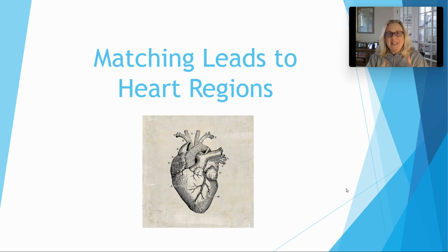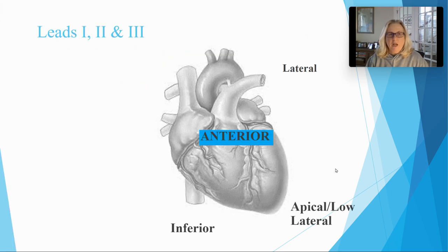So we're going to match these directly to our EKGs that we've been using, practicing on. So here's where we go. Let's get started. Okay, so this is what the heart looks like in your notes. I have your note sheets in front of me, the same one you're going to be using. I have it right in front of me.